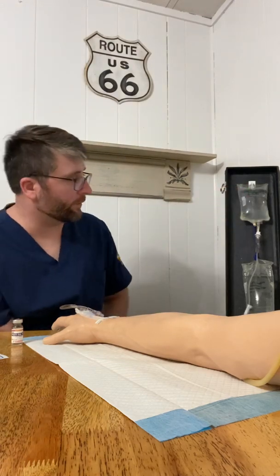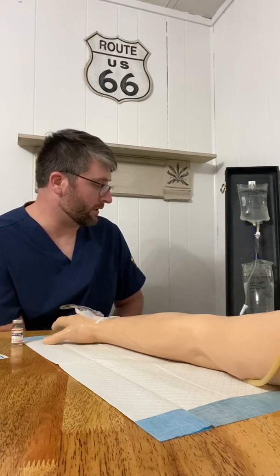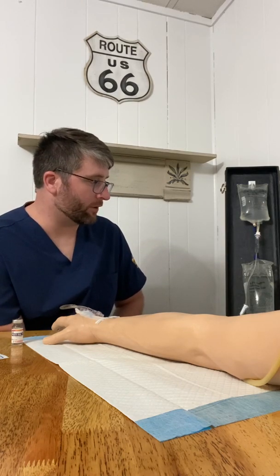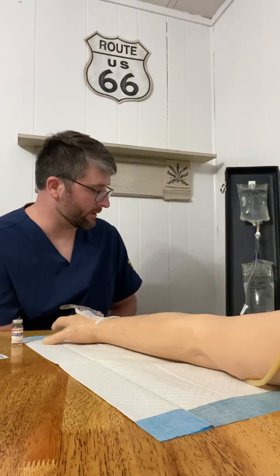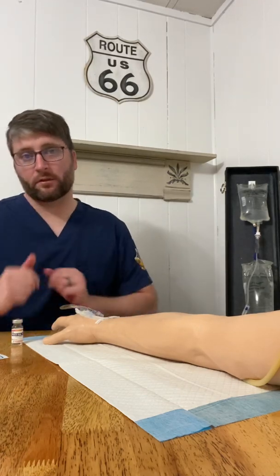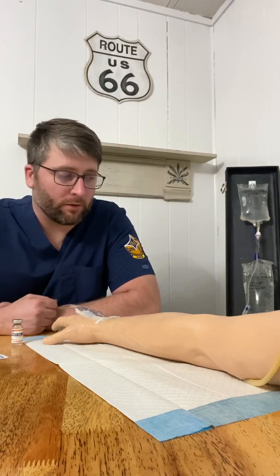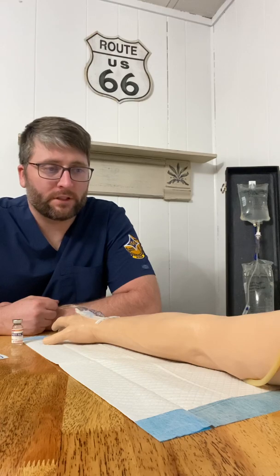And also, before we did this, we're going to write up on our bag what the medication is, patient, the flow rate, when it should be completed, and my initials as well. And then check the patient's reaction to the new medication, and then lower the patient bed to a safe height. We're going to monitor and check back with the patient as directed by facility policy and procedure.